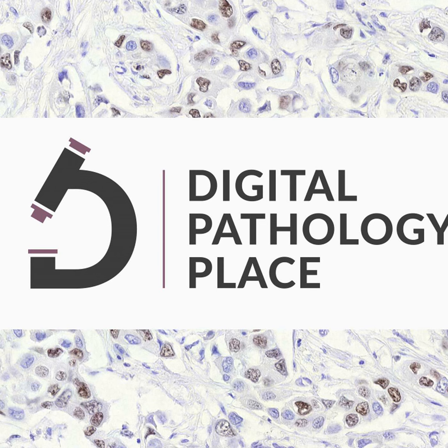But to address this, TrueCam was developed. So the first thing was, okay, we check which of our data are out of scope. And this is fantastic because you can already say, okay, I will use this particular tool on part of my data. This maybe has to go with a different algorithm, or maybe it has to be visually assessed by the pathologist. Then, the second thing, ambiguity-guided elimination of tiles to filter out highly ambiguous regions, addressing the data trustworthiness. I think it's good. If it's ambiguous, why do you force a tool that you don't know if it's going to work? And then conformal prediction to ensure controlled error rates.